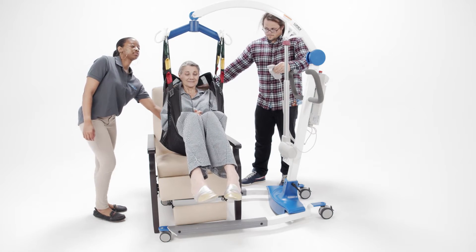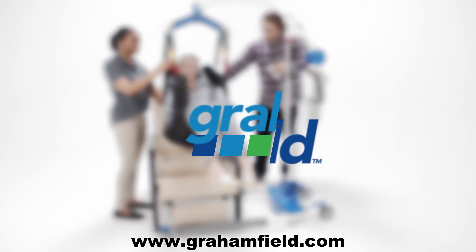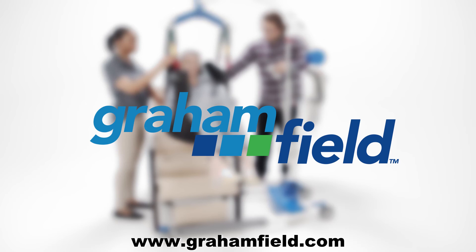Proceed with lift and transfer. For more information on Lumex full-body slings, please refer to your instruction sheet or visit grahamfield.com for more information.